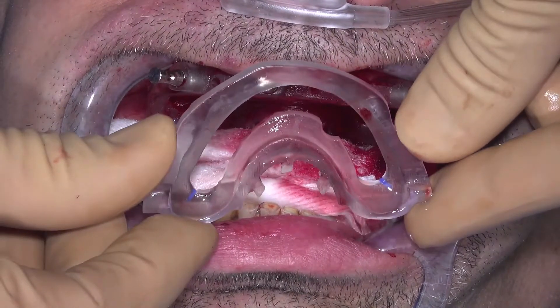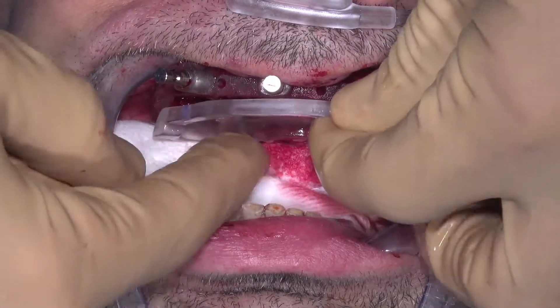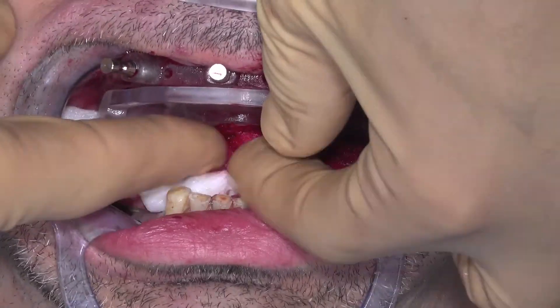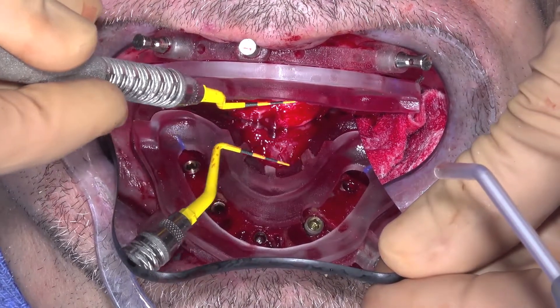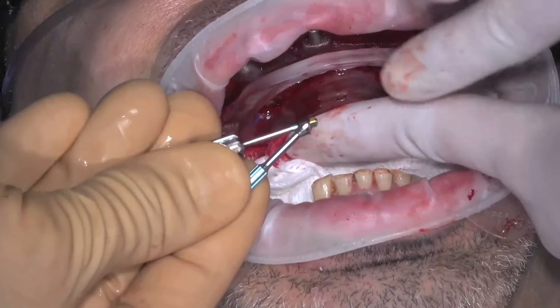For angled implants, an angle rotation guide will be provided. Seat the angle rotation guide into the bone foundation guide, ensuring that the palatal keys are flush into the palatal slots of the bone foundation guide. This angle rotation guide will help you to align the angled multi-unit abutment into the correct hex position of the implant.